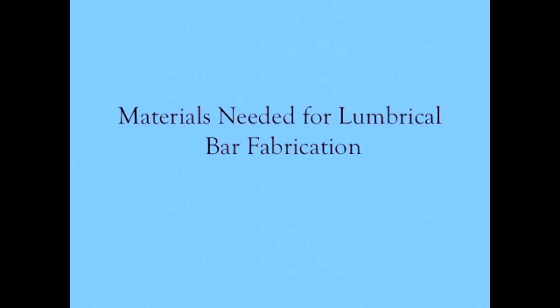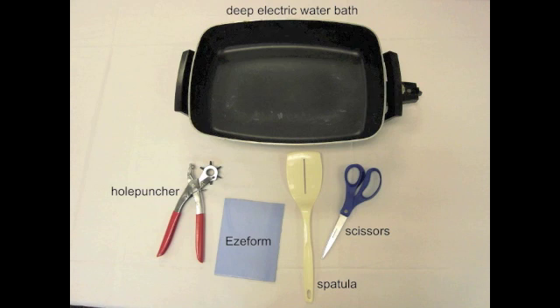These are the materials you will need to fabricate the lumbrical bar splints. You will need a deep electric water bath, a hole puncher, a piece of easy form material, a spatula, and a pair of scissors.